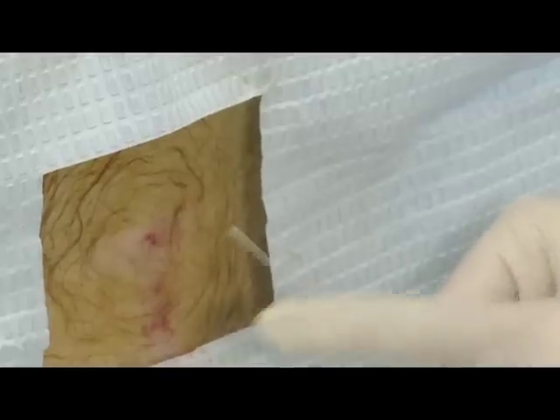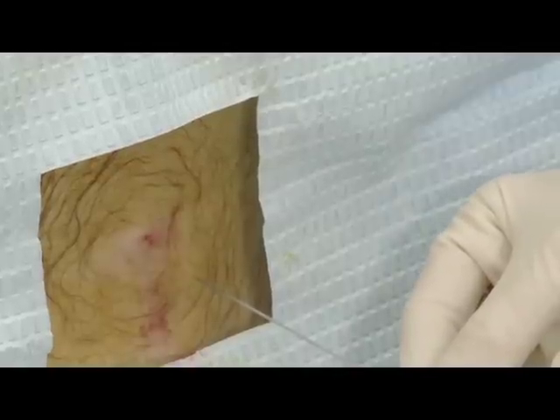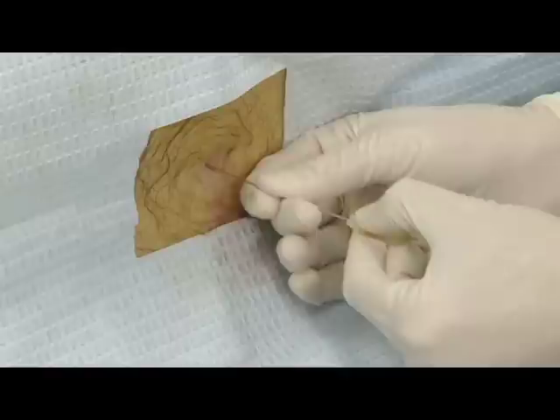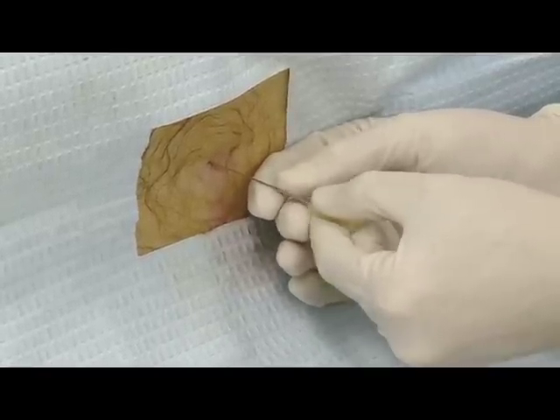Insert the spinal needle such that the bevel is in the plane of the longitudinal fibers of the dura. The needle should be turned so that the bevel will be towards the patient's side. Angle the needle toward the umbilicus, which is approximately 15 degrees toward the head. Use a slow, steady force to pass the needle through the tissue layers.